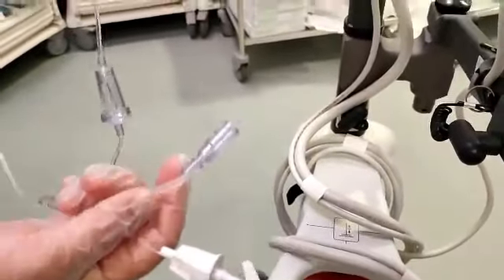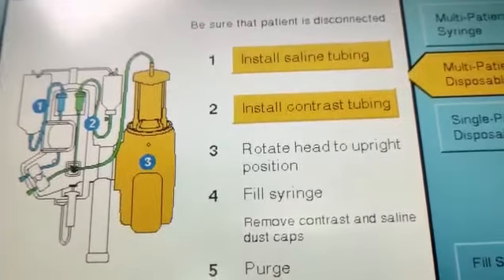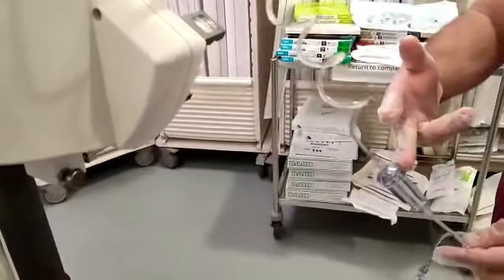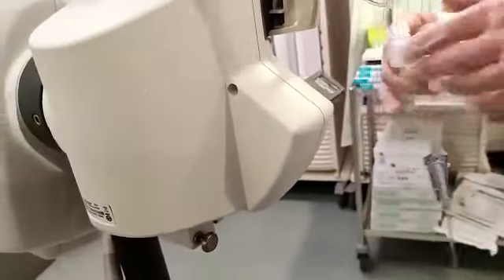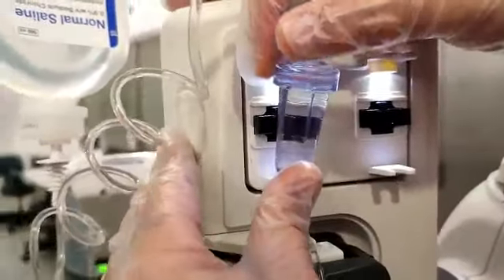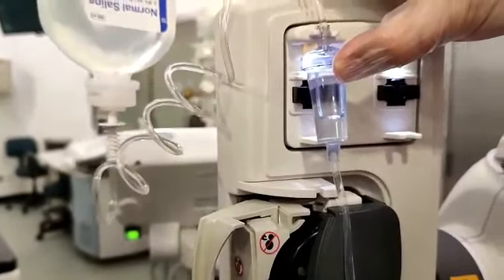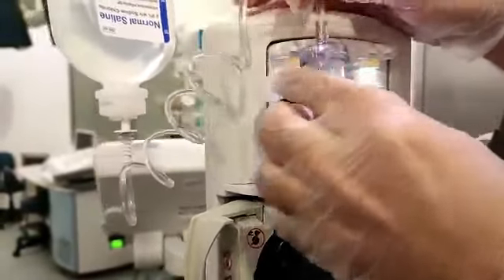These are the tubings; I will show you how to install them. The instruction says to install the saline tubing first. In the multi-set, there are two types of tubings: one is the saline tubing and one is the contrast tubing. This is the chamber — you need to fill the chamber, but before that, install it properly. Make sure there is a click sound from the bottom. Some people install it loosely and the power injector will keep giving an error, so proper installation of the tubing is important.